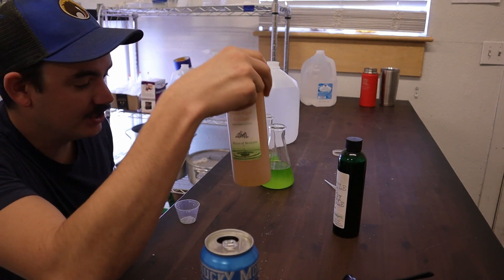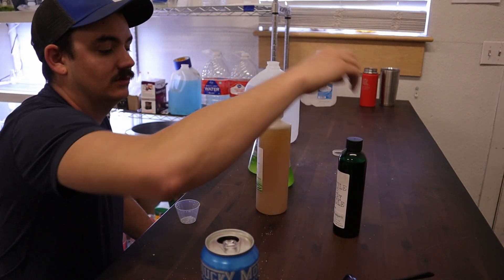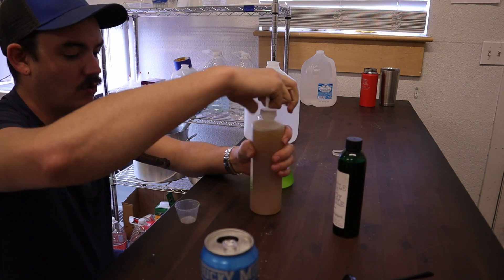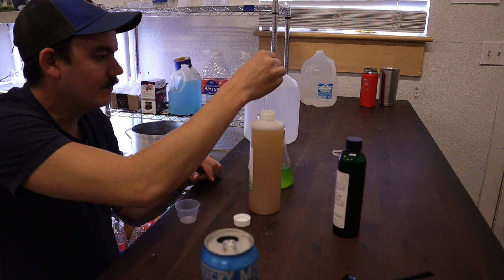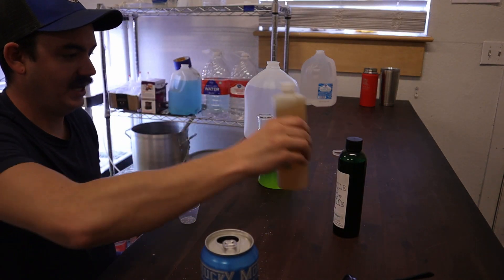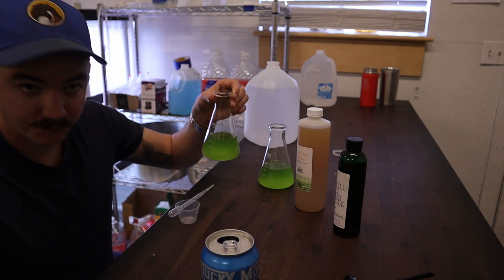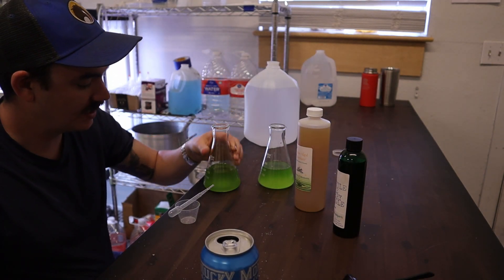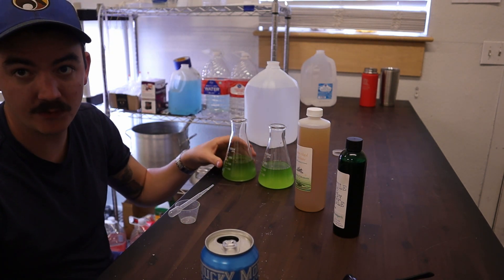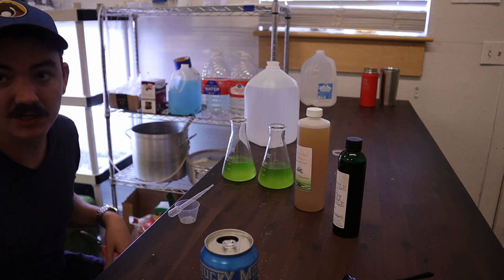We'll slow this down right now just to start — just go one mil, one tenth. Beautiful. The plan is to put the bubblers on and have them running 24/7, just like the pond water. Let's get them under their light.